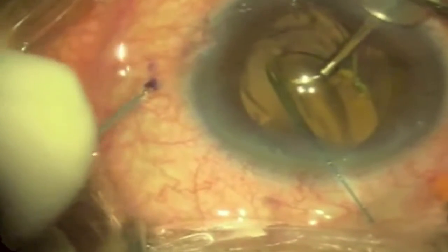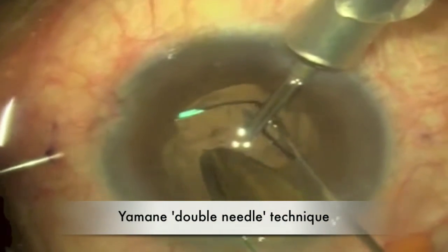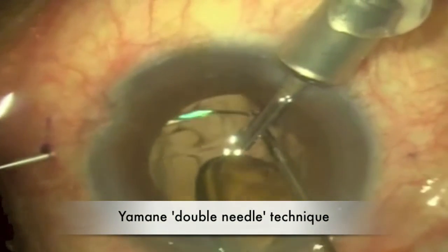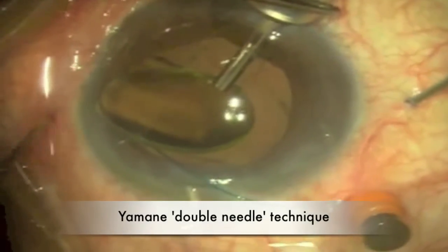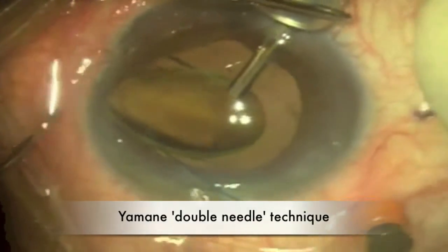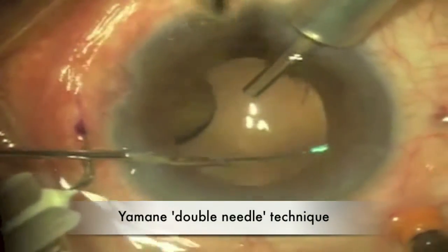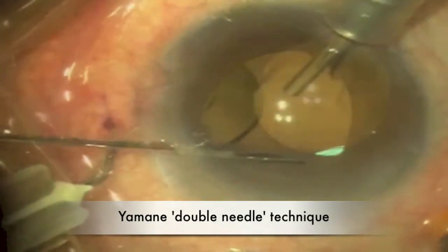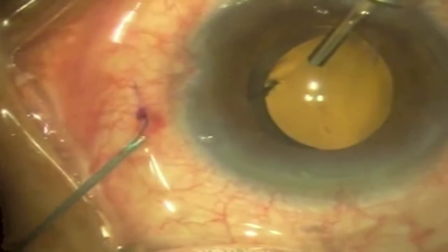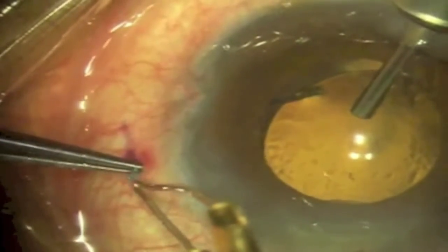The conjunctiva is first marked 2 mm posterior to the limbus 180 degrees apart, and subsequently 2 thin-walled 30-gauge needles are inserted to exteriorize first the leading haptic of a 3-piece intraocular lens, followed by the trailing haptic as illustrated here. Low-heat cautery is then used to create flanges at the end of each haptic, which is then buried into the scleral tunnels. This technique in my hands has provided very central and stable haptic fixation of the intraocular lens.